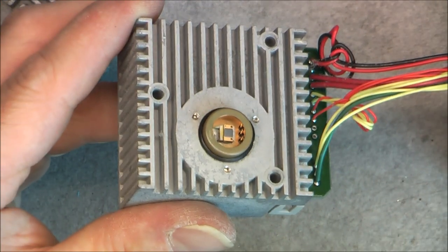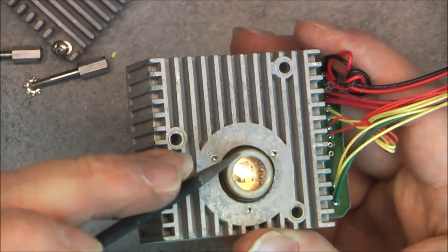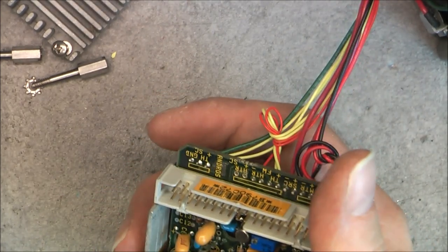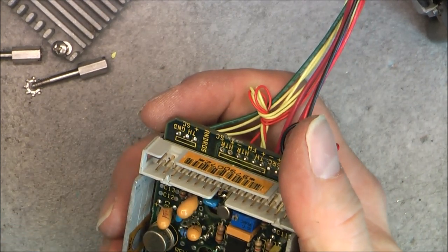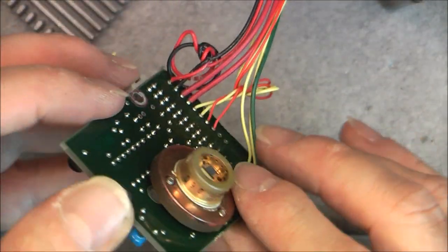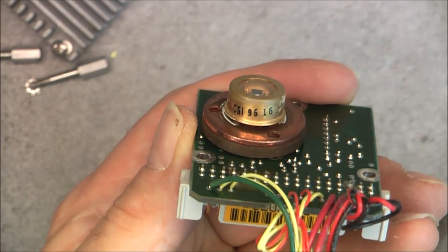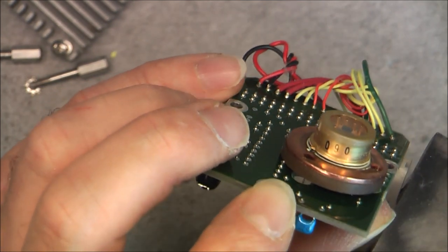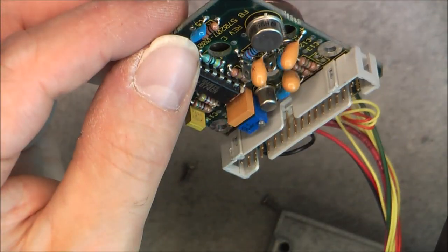It looks like we have in here something with a little Peltier cooler. Yes, you see the white area. It is a Peltier assembly and we have a sensor mounted on top of it. So super, super nice. I believe if I undo the three Phillips screws in here, we will have possibility to undo and have a better look. But there is no, maybe here, CSI9616, so seems to be just a manufacturer code, and date code, and 069 or 090, with a copper piece here, so super, super nice sensor.